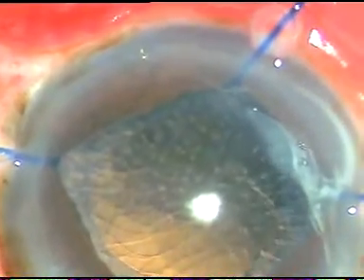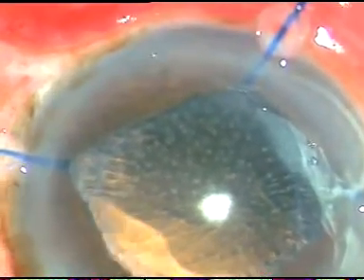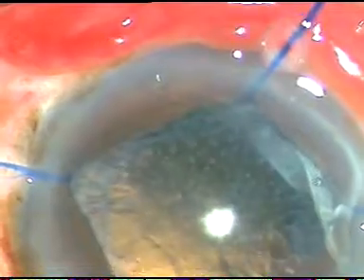Now you can see white dots on the posterior capsule — similar findings were there a few days back. I inject some viscoelastic substance and remove the cortical matter with a Simcoe cannula. This is a 23-gauge Simcoe cannula and the cortex is coming very nicely. But these white dots will not come — they are on the posterior surface of the posterior capsule. This is a unique phenomenon. I have seen these white dots only in this case, and this patient had pseudo exfoliation in both eyes.